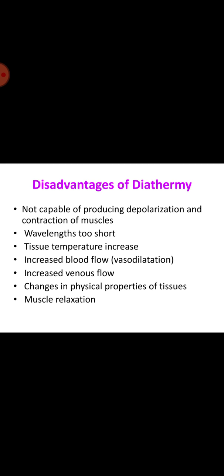A simplified method of coagulation saves valuable time since bleeding can be arrested immediately by touching the spot briefly with a coagulation electrode. A high-frequency apparatus is regarded as standard equipment in the operating theatre and it is kept ready for all surgical interventions even if high-frequency surgery is not intended, so that use can be made of its superior method of electrocoagulation.